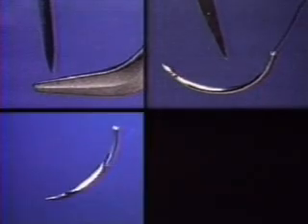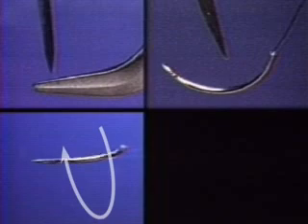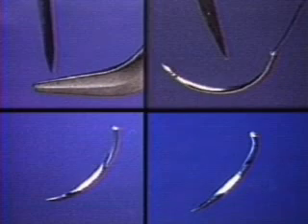First, you need to pick it up with the right part of the needle holder. Second, you need to pick the needle up at the right point along its length. Third and fourth, the needle must sit at 90 degrees to the needle holder, both in this plane and in this plane. Let's look at each of these points and see why they're important.